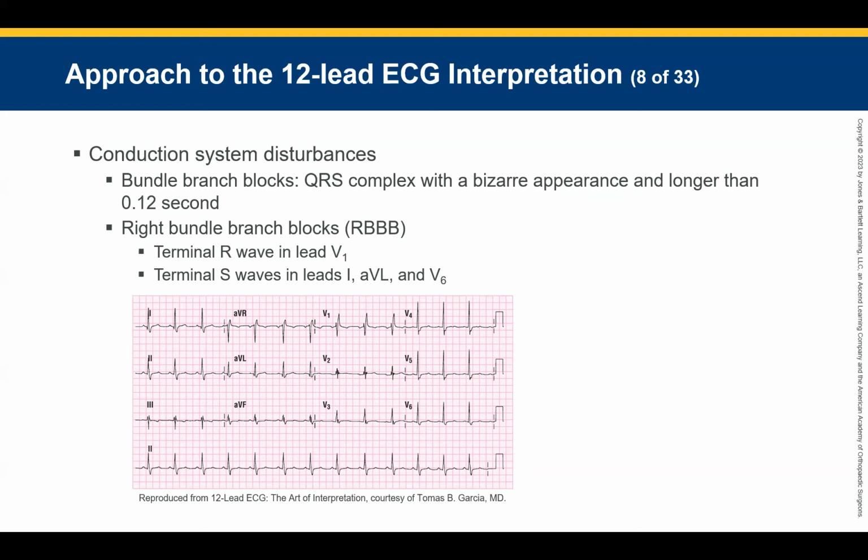Because you may see something funky in V2. See how this printed funny here? In V2, there's like a couple squiggly lines. I can't see what that is. But I'm going to look across the board vertically and say, what does that look like in other rhythms? Is that a PVC, a PJC, a PAC? And I think it's just a bad squiggle. We just got some interference. The printer jammed a little bit. I don't know. It doesn't look super clean. But we use that whole picture to say, it's not such a big deal.